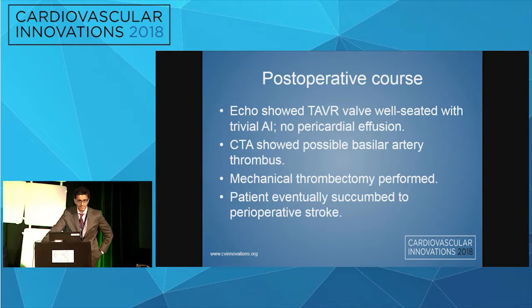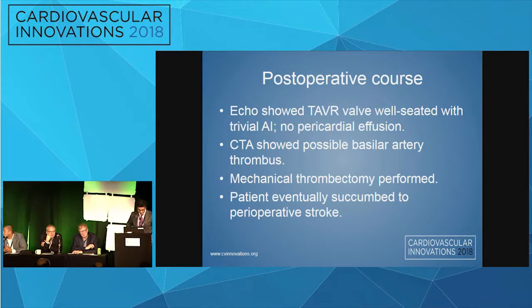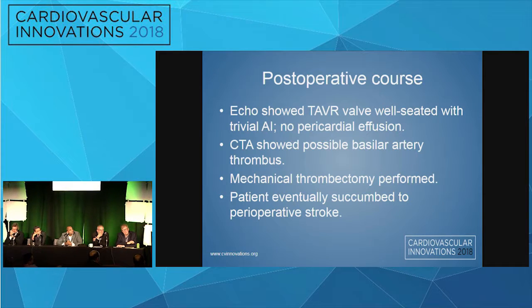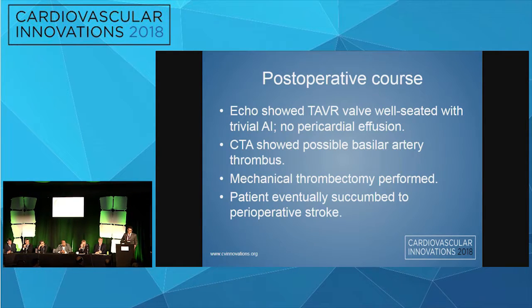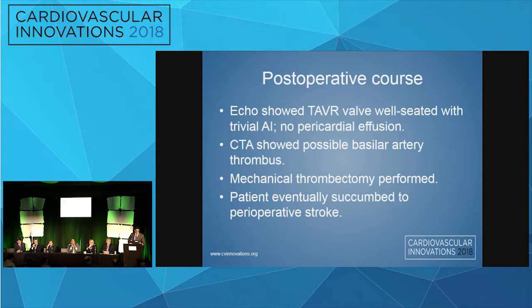Or you could use Sentinel too. That's another thing, you could use cerebral protection. How it went there is a question, but anything is possible. But the way the aorta was, it's very unlikely. If the guy hadn't gotten hypotensive, you'd have done fine. It was doing fine. You could go either way. You might not have had this. Who knows? It's maybe six of one, half a dozen of the other.